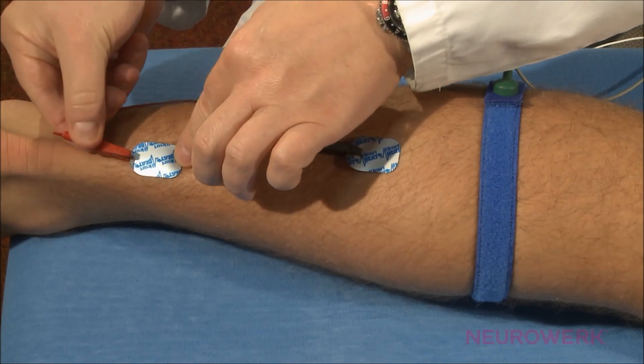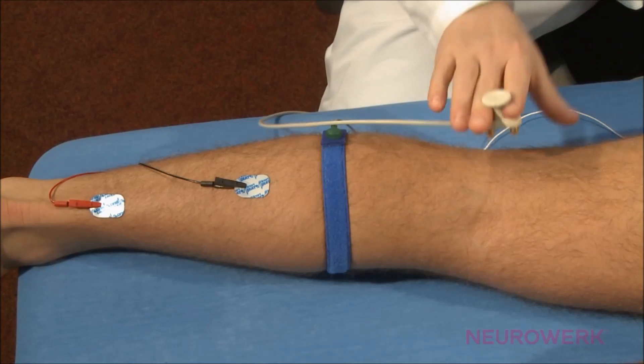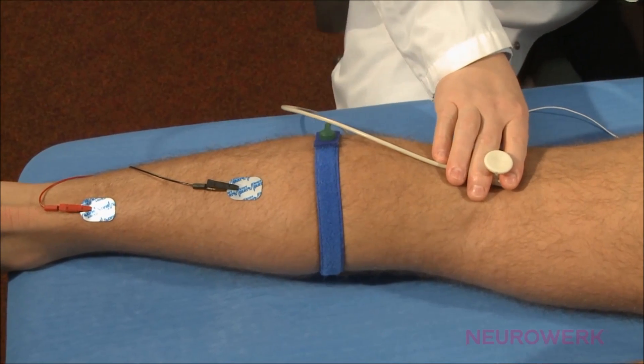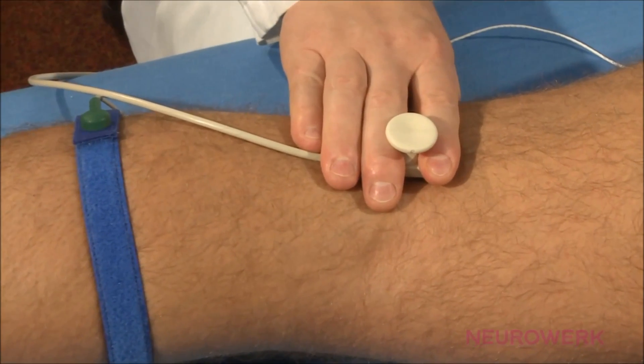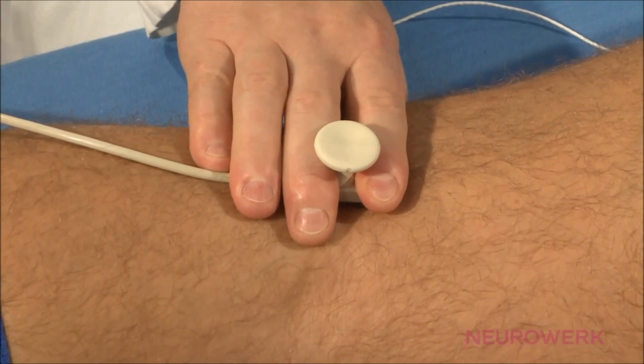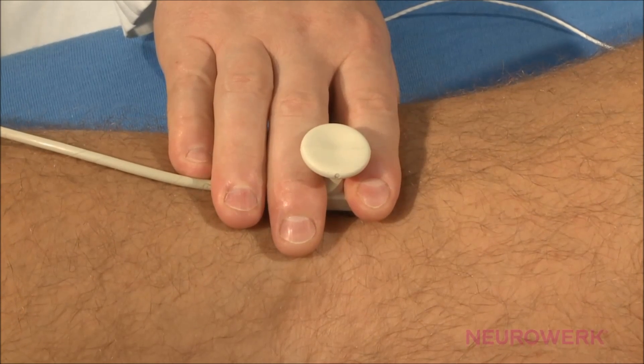In adults, the H-reflex is usually only measurable in the tibial nerve. The nerve is stimulated in the popliteal fossa, and the recording of the triggered potential takes place in the middle of the calf above the musculus soleus.